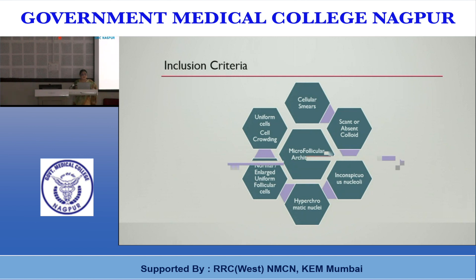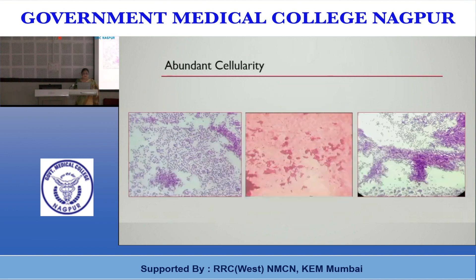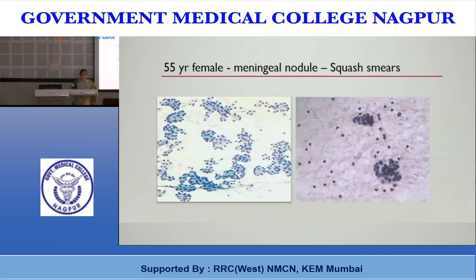One can see abundant cellularity and repetitive follicular arrangement, with some colloid in the background. In a case of a 55-year-old female presenting with a meningeal nodule, squash smears showed an abundance of uniform, equi-sized follicles — so characteristic that the primary could immediately be pinpointed to the thyroid.